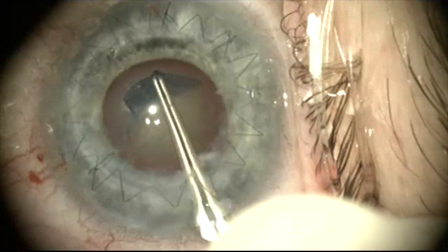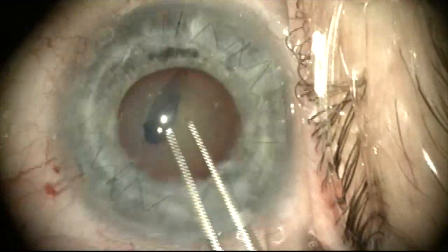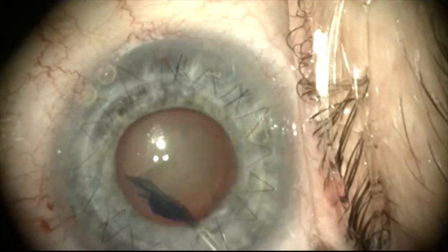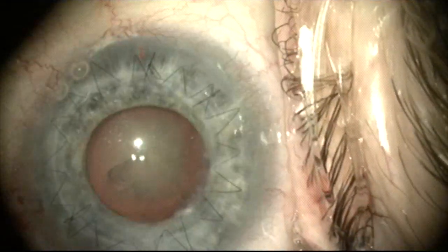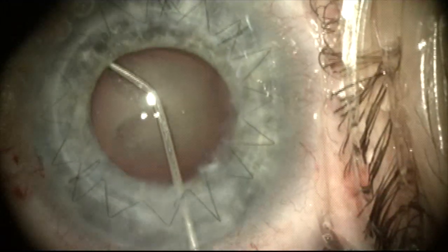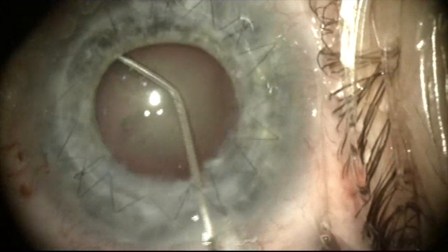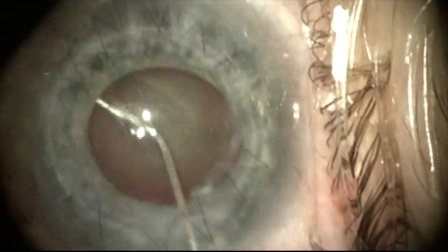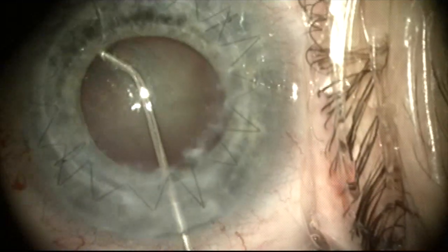We're doing a routine capsulorhexis. Although the rhexis looks somewhat small, it's actually quite large because this is a very large eye. Hydrodissection of the nucleus is performed and phacoemulsification will be carried out in a pretty routine fashion.